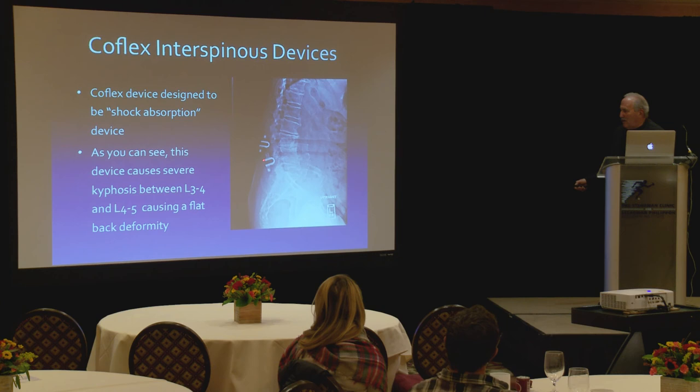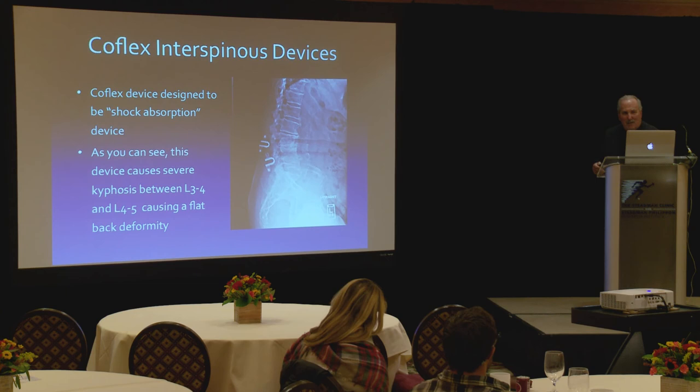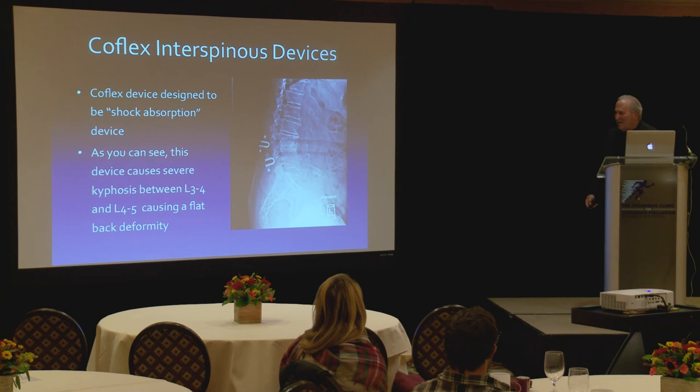These are devices that are spring-loaded clips that are supposed to be put in between the spinous processes. Look at the kyphosis here. So it's a forced kyphosis. Why don't you simply just do a central laminotomy decompression and open the canal? Makes sense. Nope. Let's try something new and shove something in there that doesn't work. Sorry, I get a little upset about some of these things.